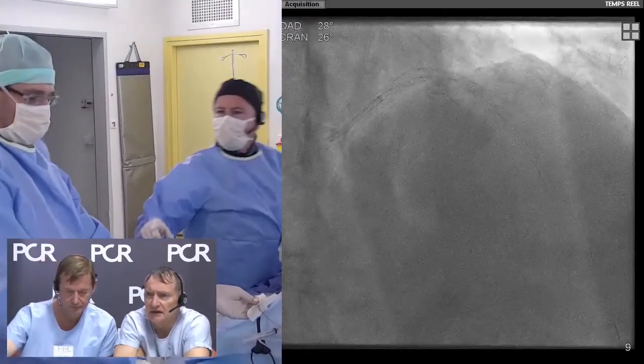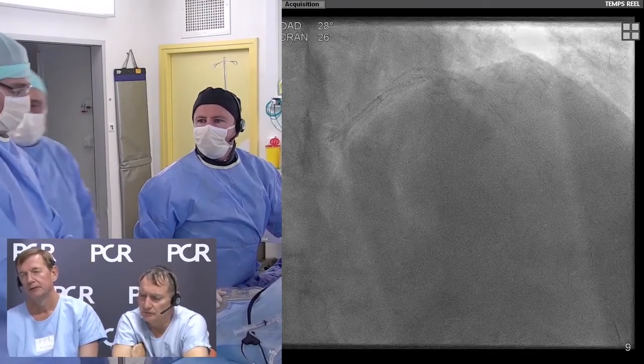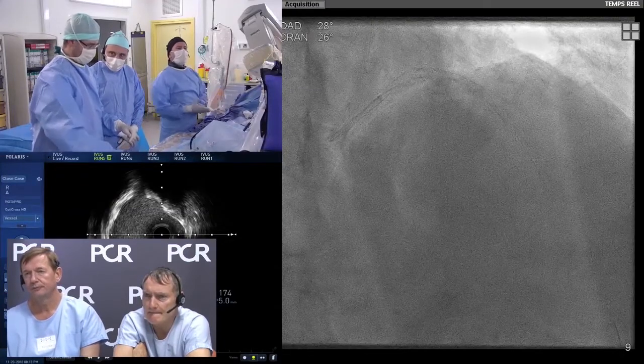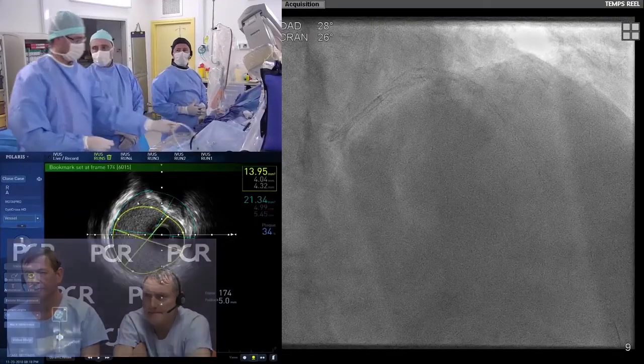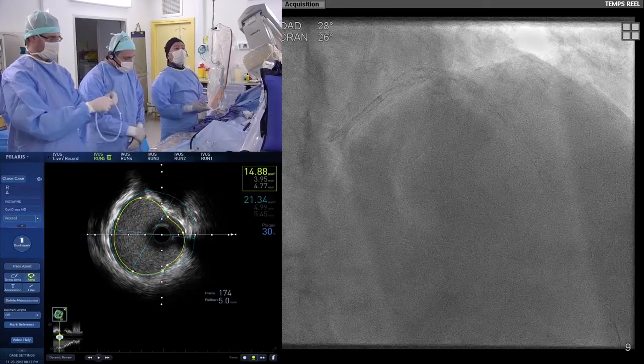Tu peux mettre en milieu là le tronc, il fait combien? 5,5 ou pas? Avant. Sorry. So there's a question about pharmacology. Okay, a balloon 5.5, it will be better. A balloon 5.5. We follow you, Adam.